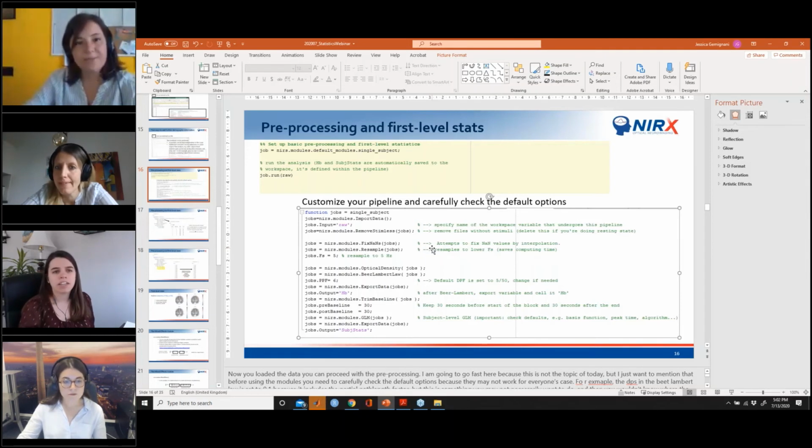Okay. Yes. The next question we have: would you recommend to report the results of both ANOVA and mixed effects models, or only one?